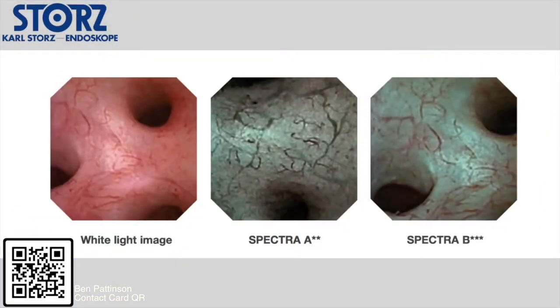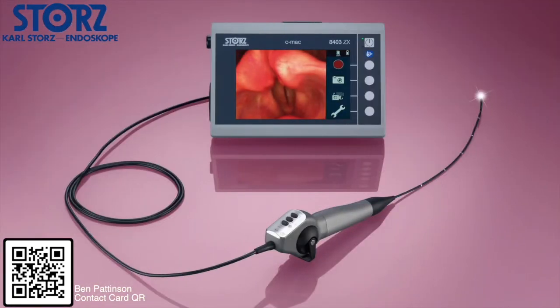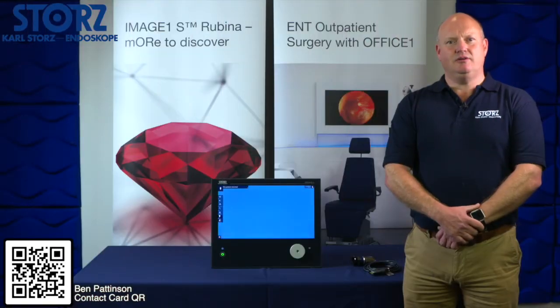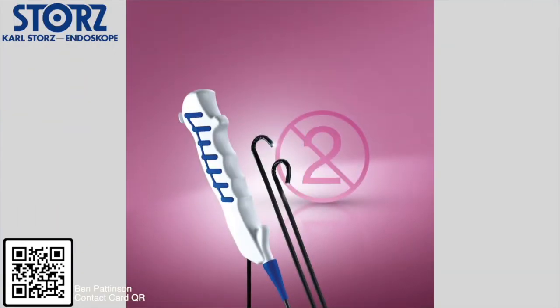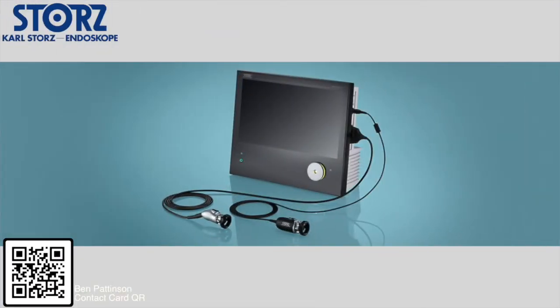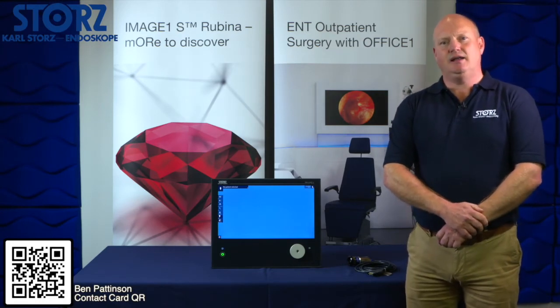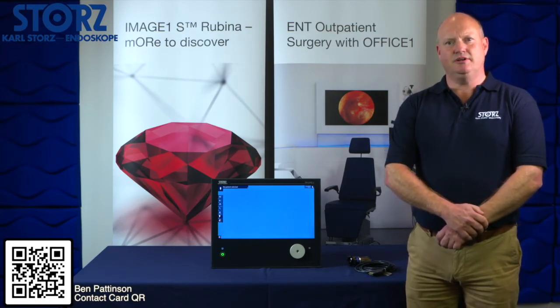The Spectra modes are very similar to what is available from our competitors, namely i-scan and narrowband imaging. The system will also connect to a lower cost video flexible nasendoscope, which is cost-wise very similar to a fibre optic scope. However, the features mentioned before are not available on that particular scope. And if needs be, there is a single-use endoscope which also connects to the system. The system will also attach to a standard camera head, which will facilitate connection to your existing flexible fibre optic scopes and rigid endoscopes that you already have in the clinic.